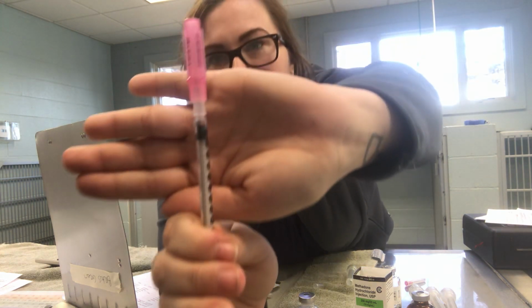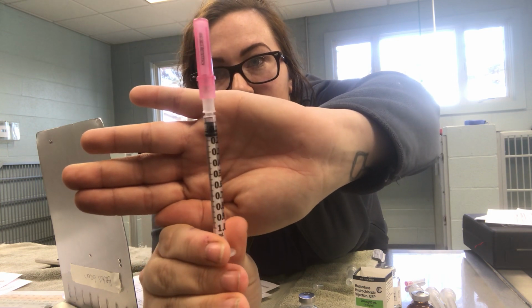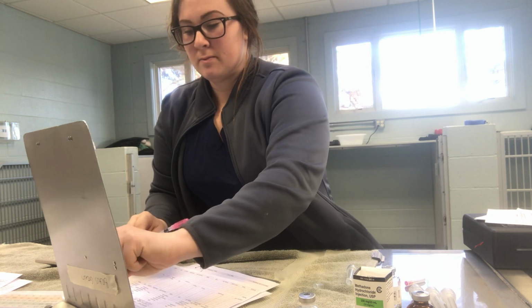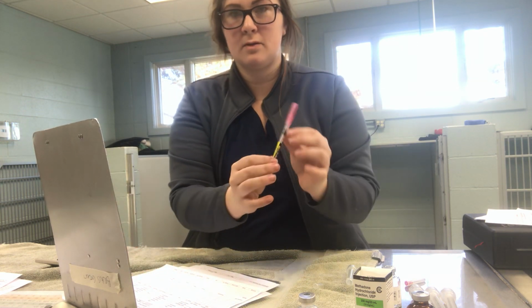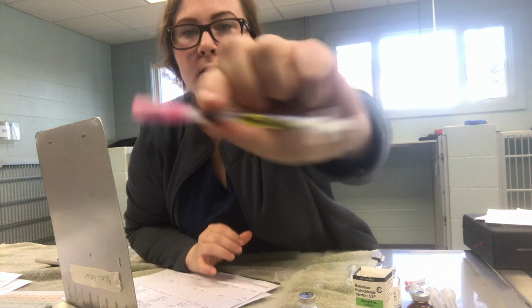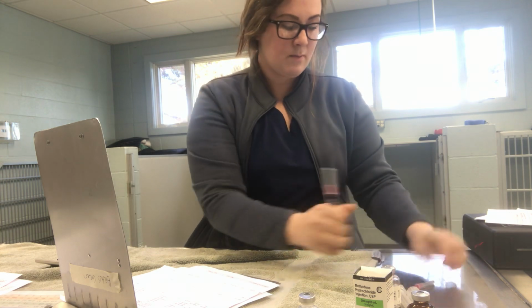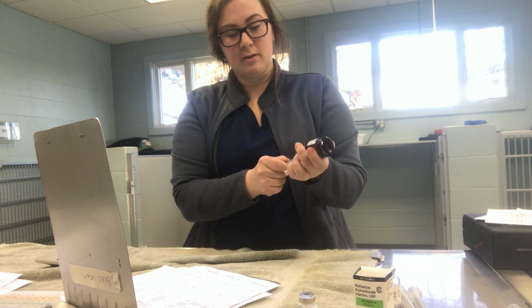Okay, so you can see there it is 0.04 mLs. And we're going to label that syringe. Okay, so you can see the methadone label is on there. And then we're going to get our diazepam, which is going to be 0.08.